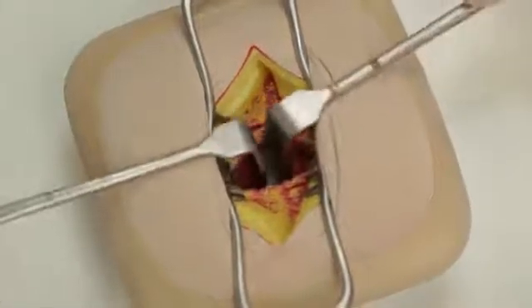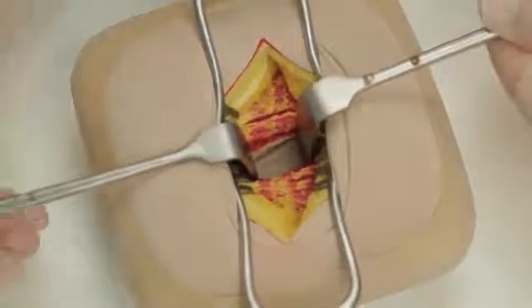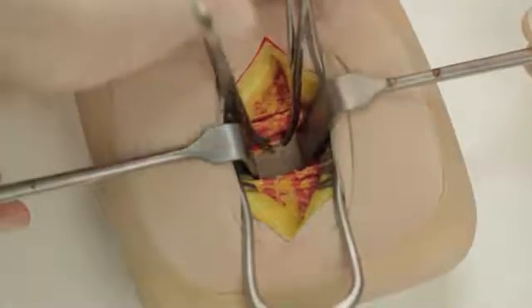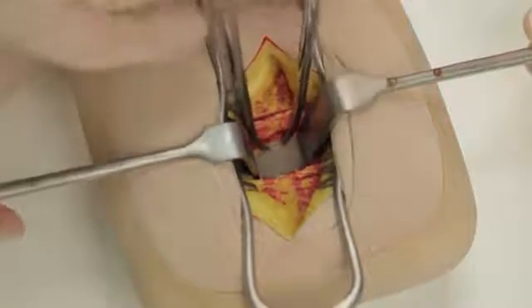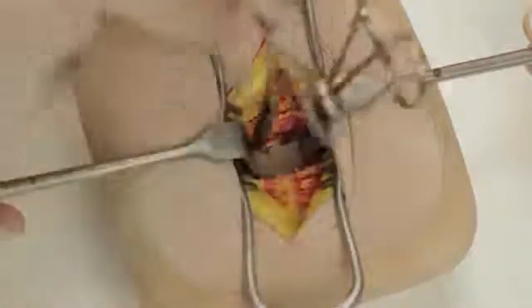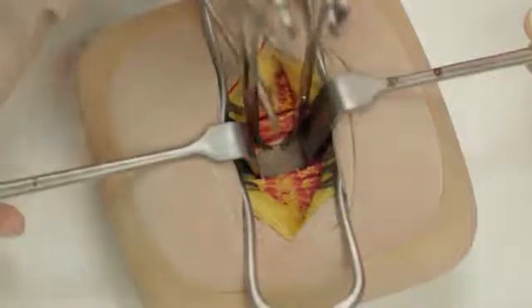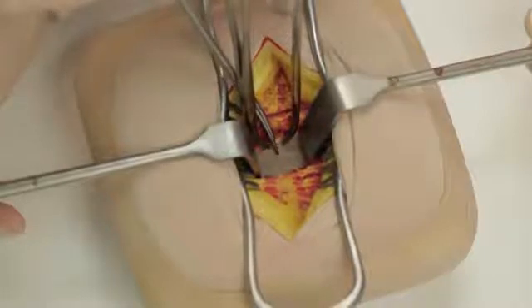Beneath this muscle, the fused transversalis fascia and peritoneum will be visible. Apply two mosquito forceps to a fold of peritoneum and ensure that only peritoneum is held by pinching it between your fingers. Make a small incision in the peritoneum using either dissecting scissors or a knife, and enlarge the hole in the line of the skin incision.